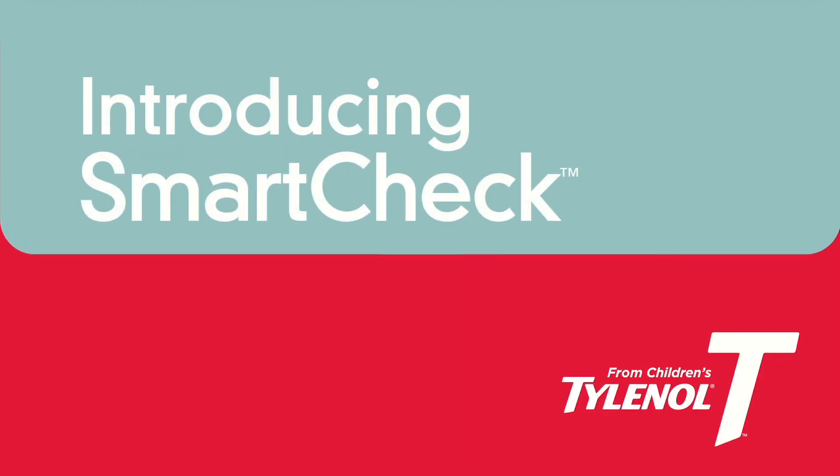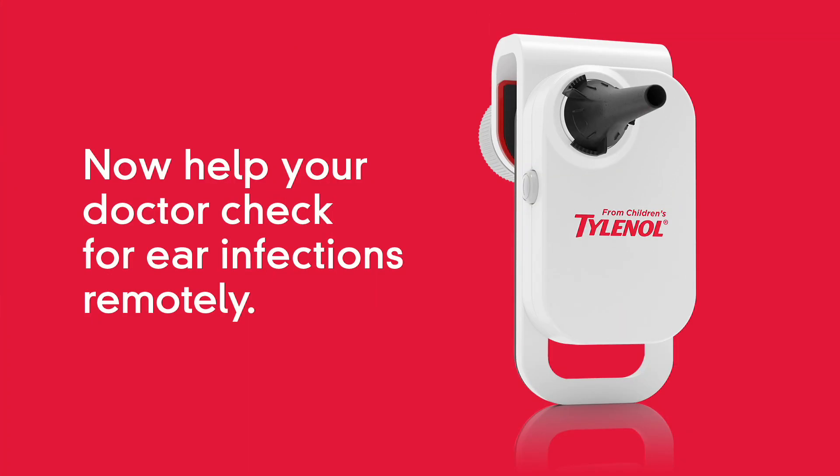Introducing SmartCheck from Children's Tylenol. Now help your doctor check for ear infections remotely.